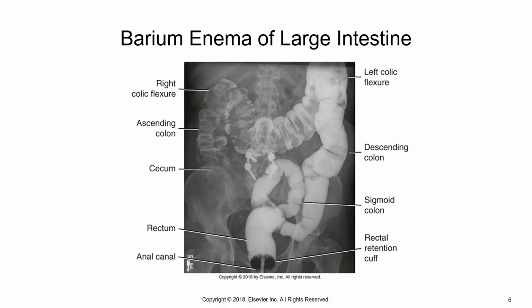This picture of a barium enema appears like it could be a double contrast BE, but it also might just be the fact that the barium hasn't made its way all the way around, but they're doing an overhead. I'm not really sure why. You can see the enema tip right here along with the inflated retention tip, a retention balloon. So that is still in the patient when they took this.